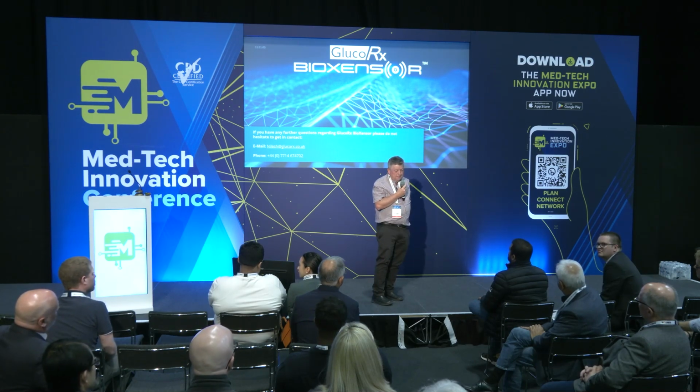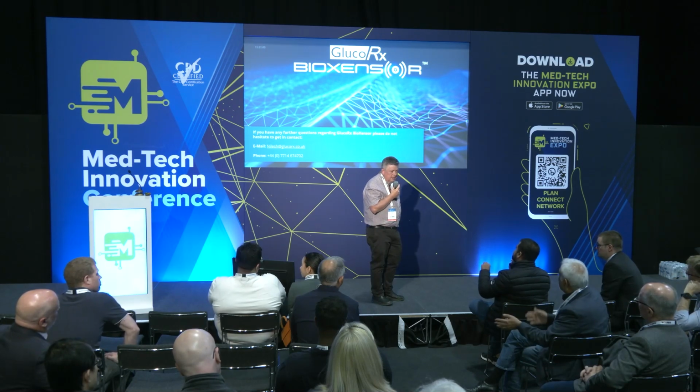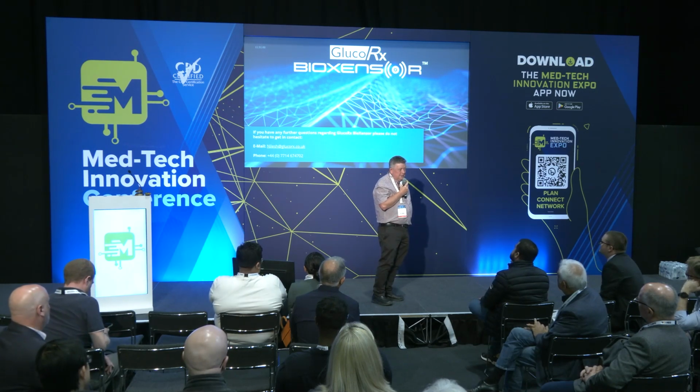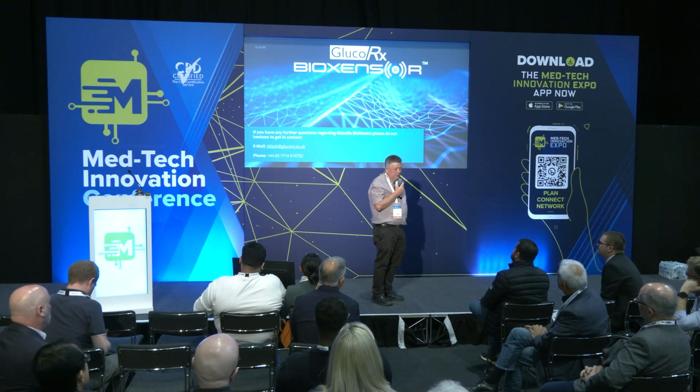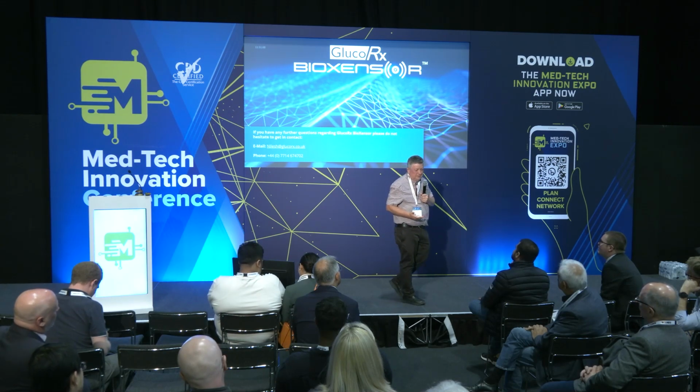Sure. Another question: it says it's a wearable device, but it seems kind of like the FreeStyle Libre. You have to wear it for a few days, or it's just a sticky bit underneath that? You can stick it on. The interesting thing with our sensor is it's non-chemical, so there's nothing actually to wear out in it. It's battery operated, so you have to recharge the battery, but there's nothing chemical there. With the FreeStyle Libre, you do have to take that sensor out at some point. Our sensor just keeps sitting on the skin. It's purely electronic based.